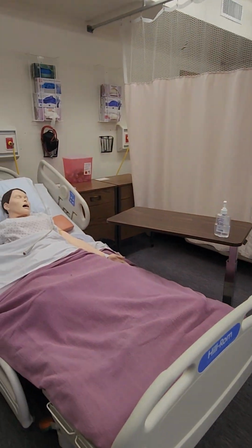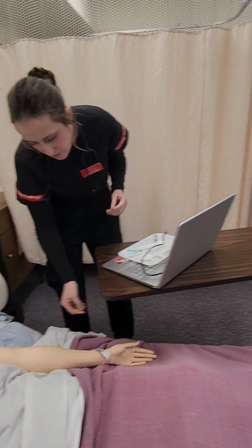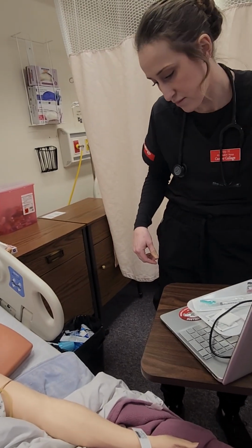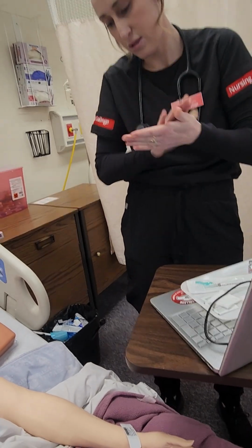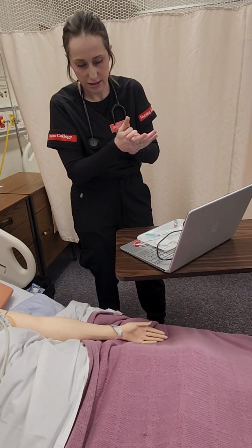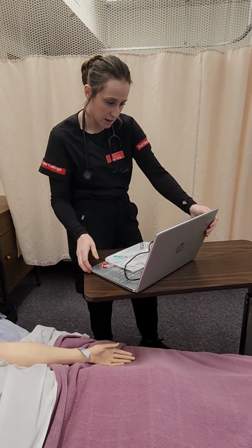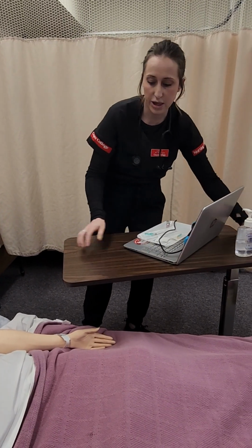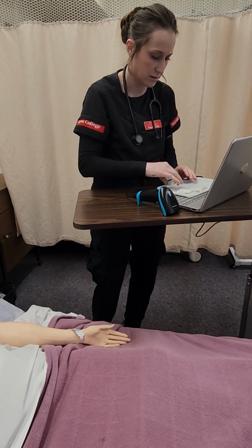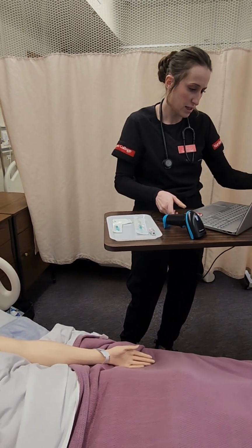Knock, knock. Hello. Hi, my name's Lainey. I'm going to be your student nurse. Could you verify your name and date of birth for me? Yes, it's Myla Bush, 3/28/1945. Okay. Do you have any allergies, Myla? Yes, indomethacin. All right, I can see that in your chart. I'm here with your heparin. You're due for it every 8 hours. Have you had this already? Yes. Okay. And did you have any reactions to it last time?